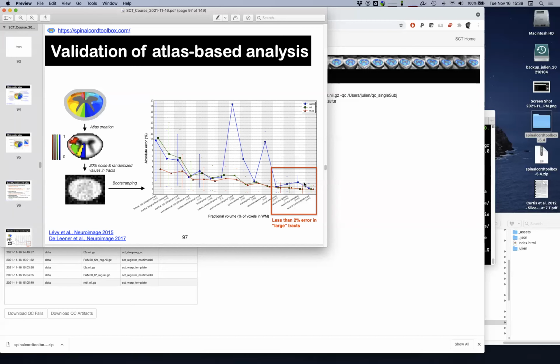Okay, when we use the maximum a posteriori method, whereas the weighted average method, as you see, can produce a high level of error. Okay, so that's why we do recommend that you use the maximum a posteriori or the maximum likelihood method. Okay.